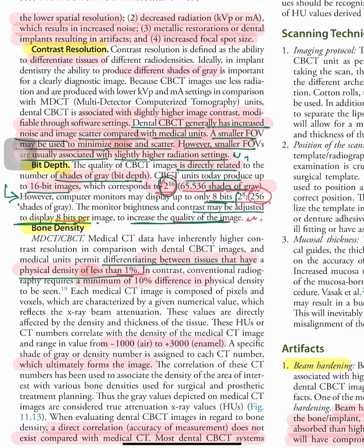In contrast, conventional radiography, the OPG and IOPAR, requires a minimum of 10% difference in physical density. Unless two structures have a difference of at least 10%, only then will they be able to differentiate it.